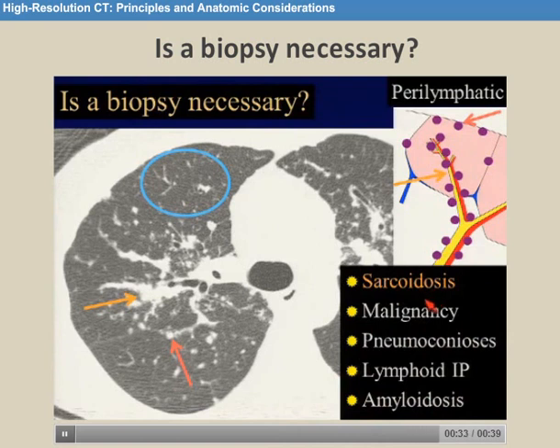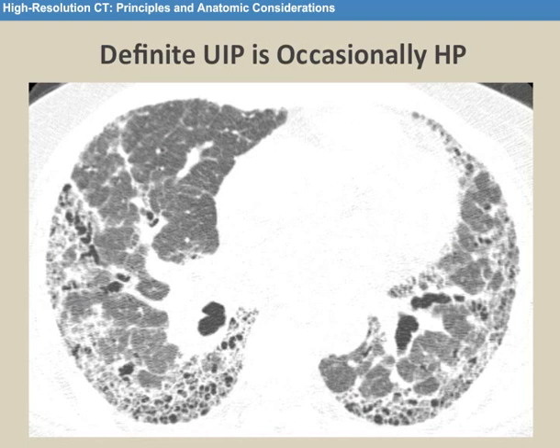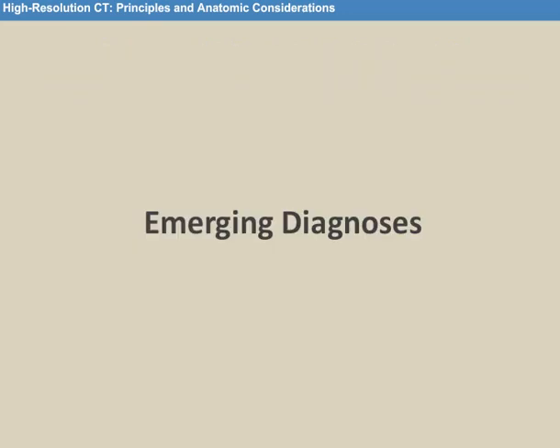And I think the answer is, well, people don't want to make a definitive diagnosis of sarcoid when the malignancy is even a 1 in a million. So then why do we accept a UIP pattern as being definitive for IPF without pathologic confirmation? And I think the answer is, well, it's much less important to distinguish UIP from end-stage HP because their survival is probably the same. Occasionally patients with hypersensitivity will get into an IPF trial because they have this classic definite UIP pattern. All right, great.